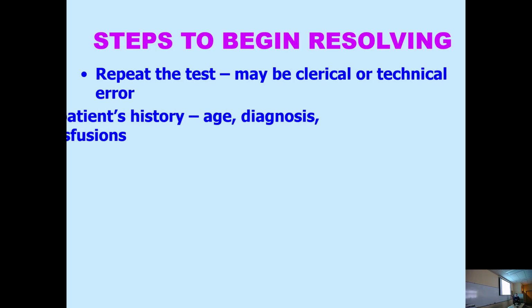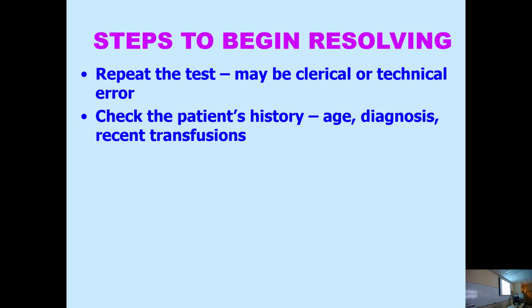What's going on? Check the patient's history, age. Very young, very old, they're likely not going to have the antibodies. Maybe you can have an issue with that. Diagnosis.